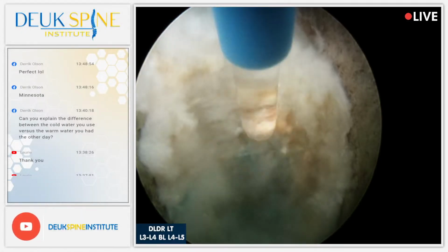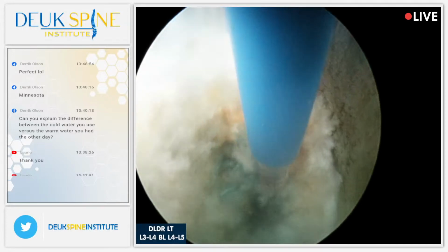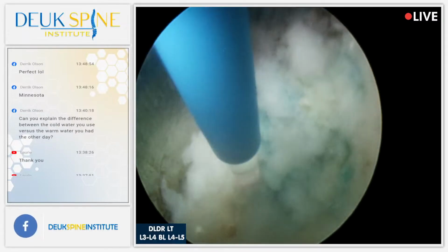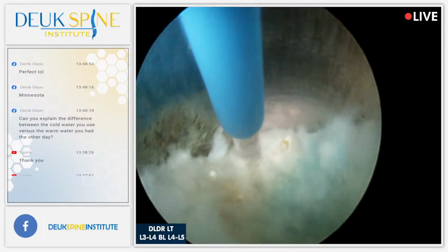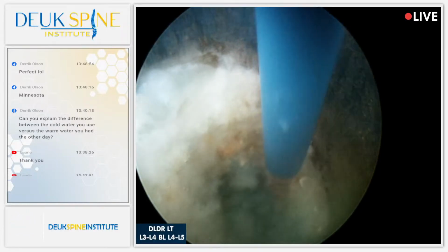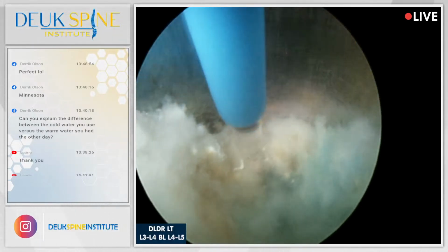Well, with the laser, there's also heat generated at the tip, not because of friction, but because some of the energy, so without getting too technical, in physics, there's this thing called energy transformation, where you basically convert one form of energy into another.